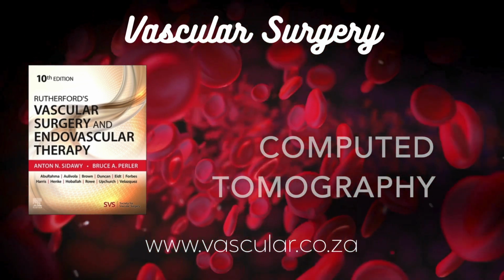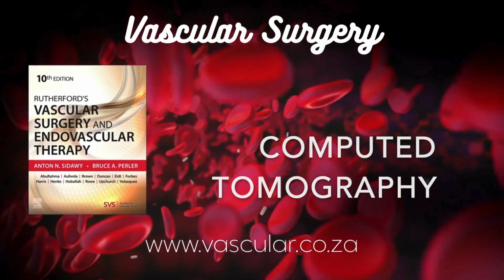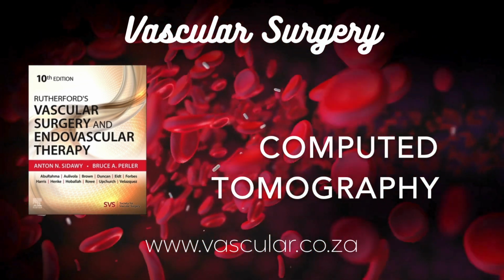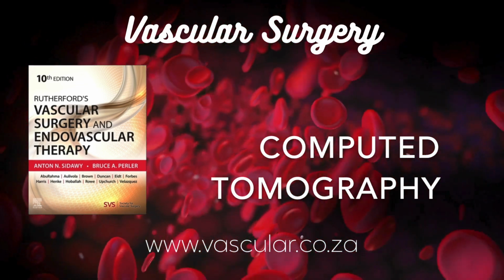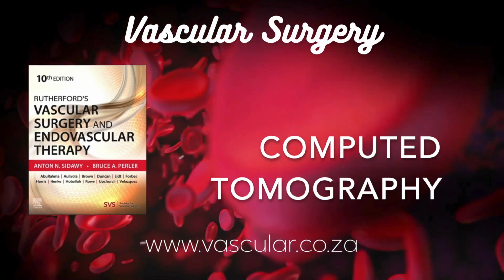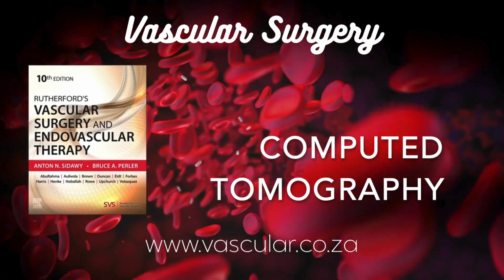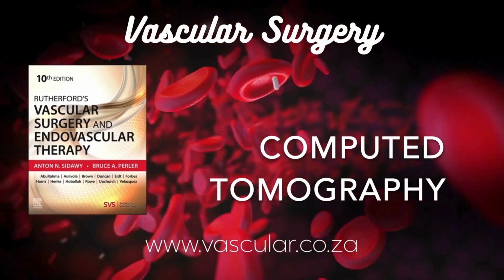The acquisition parameters. Absolutely. Every CT scan follows a specific protocol, which is basically a recipe optimized for the body part being scanned and the clinical question being asked. It dictates all the pre-scan settings. Like what? Things like the X-ray tube settings, kVp and mAs, the gantry rotation speed, how long the spiral scan needs to be, the pitch, the collimation or beam thickness, plus patient instructions like breath holding, and of course, the detailed plan for the contrast injection if it's a CTA.